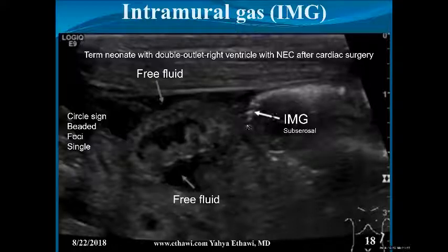After you measure the Doppler, you can also look at the intramural gas. The most difficult thing is to separate it from intraluminal gas, and sometimes also intraperitoneal gas, because when you have intramural gas, mostly you also have perforation and the gas going outside. So you can see this lumen start to thin here, and you can see some intramural gas in here. And you can see here is intraluminal gas. And you can see here is increased thickness and here is decreased thickness. You can see normal bowel wall here.